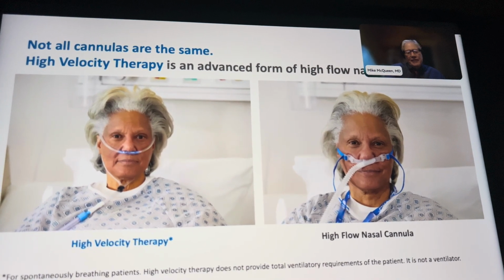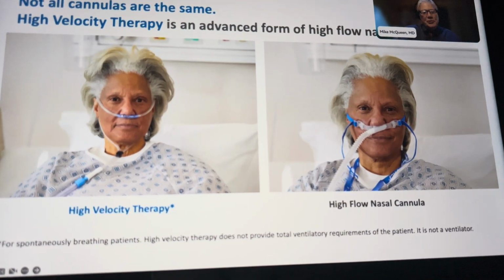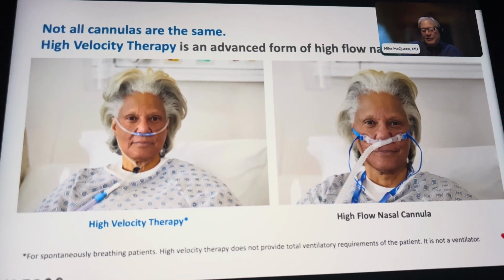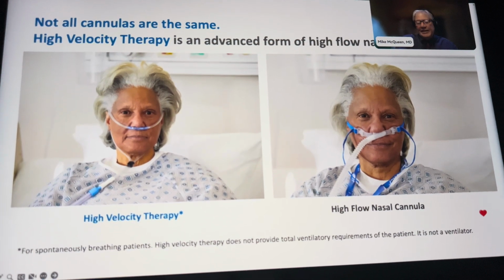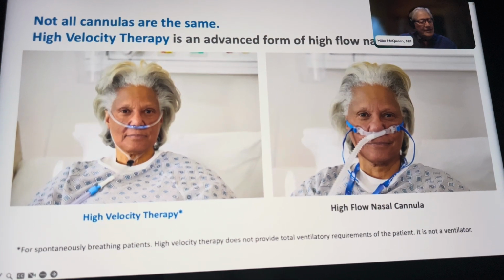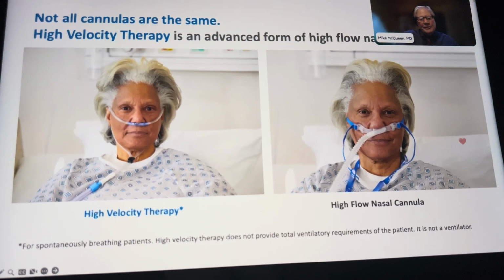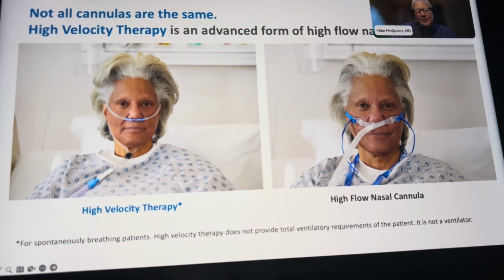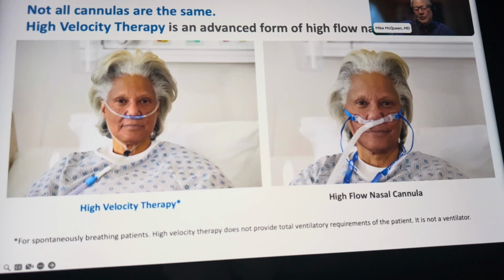I want to connect a couple of dots. Scott, you were right to mention you don't have much time during the expiratory phase to clear that CO2. And so a wind speed of 30 meters per second compared to 11 meters per second absolutely is significant. Our physio colleagues on the line will make easy math. If a patient is breathing 60 times a minute, and assuming a 1-to-1 I:E ratio, you have half a second to clear that extrathoracic dead space of CO2.